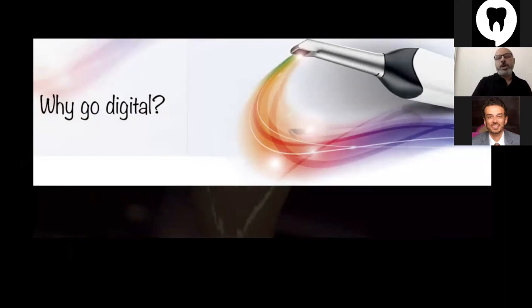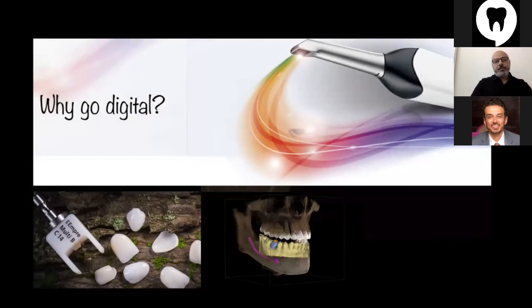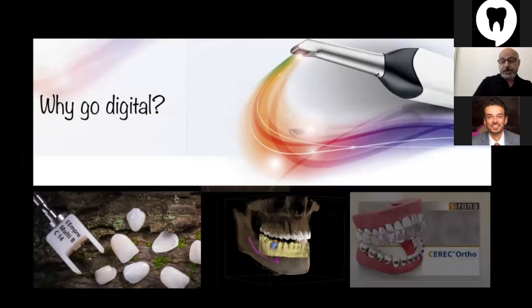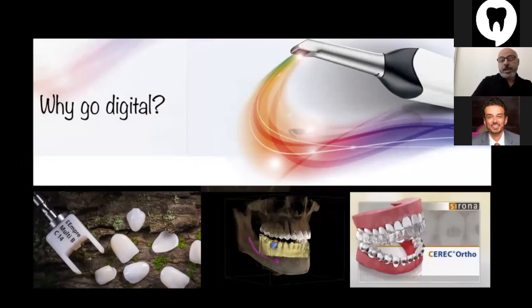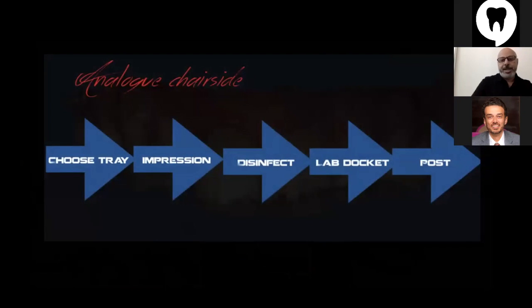But today we're going to talk mainly about the in-office workflow, completely digital from start to finish. We have lots of applications for digital dentistry nowadays, but we mainly are going to talk about restorative applications. If we compare the analog and the digital workflow, we're going to find that the analog workflow takes a lot of work and lots of steps.